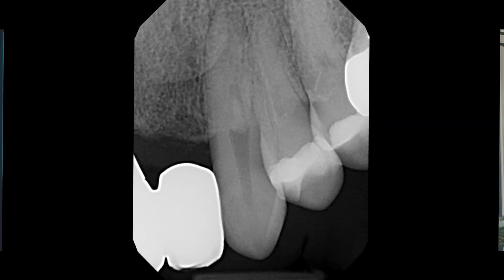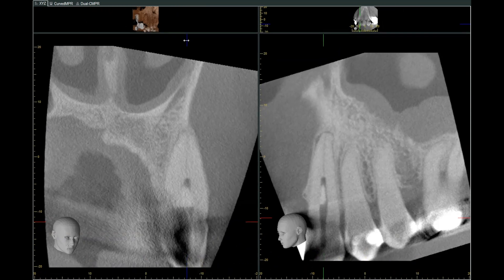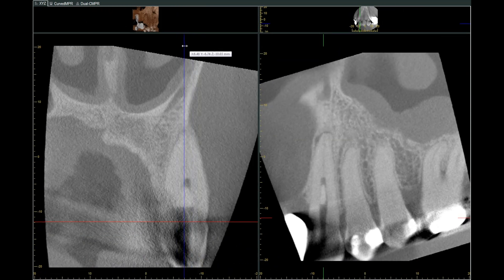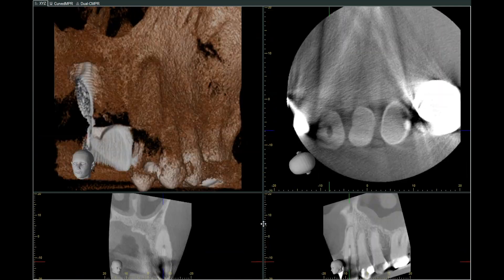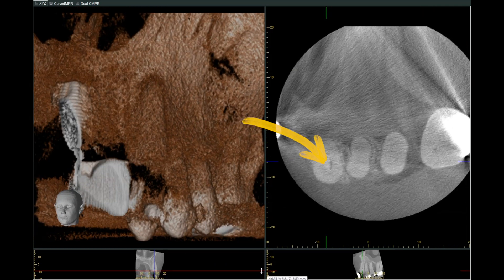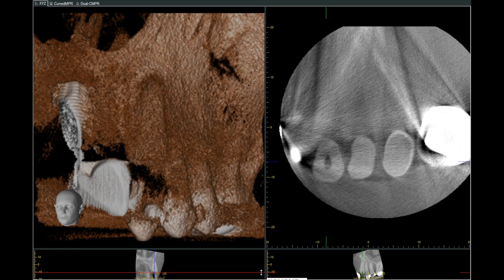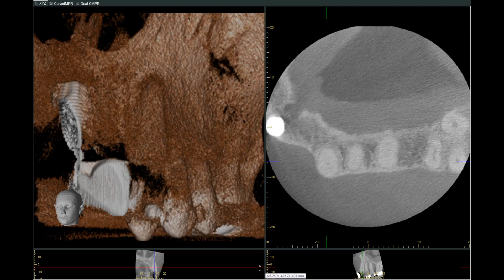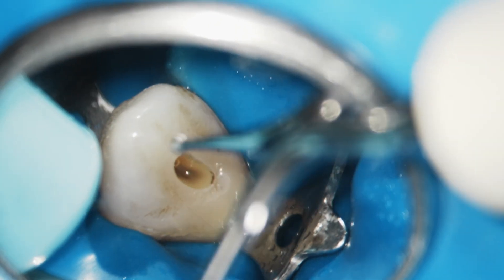As usual with a tooth like this, we want to assess what's going on. We take a radiographic image and we can see this large calcification in the middle of the tooth, closure of the apical area, and a little bit of apical periodontitis. The CBCT in the axial section shows that area in the middle of the tooth closes down, but there might be a tiny area on the side we can bypass. The problem is we have to be careful not to push this calcification down apically, as that would cause a problem.